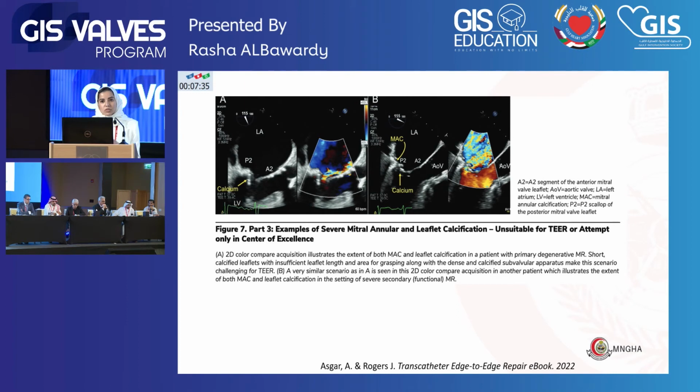Now, even for those that are outside what we call optimal, or when we reach the other spectrum of more than expanded, they could be attempted, but they have to be attempted in a center of excellence. So it's not a place where you are just starting your devices.